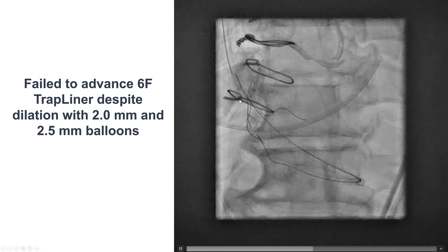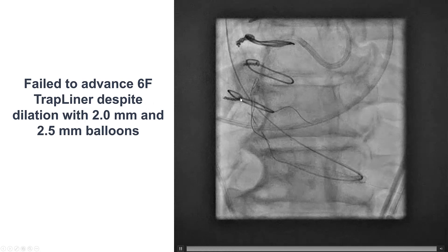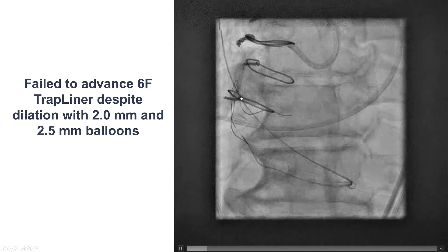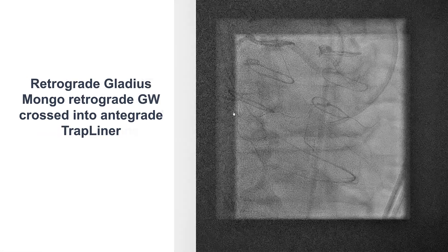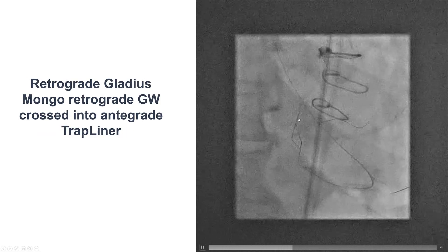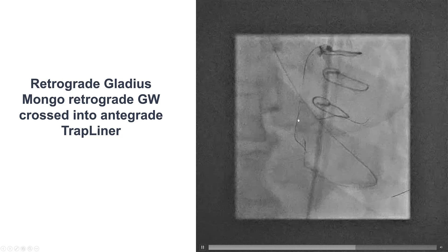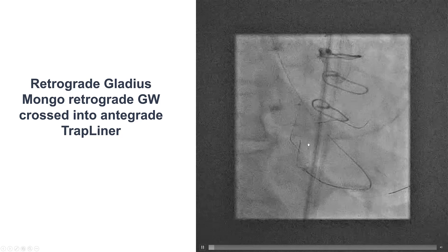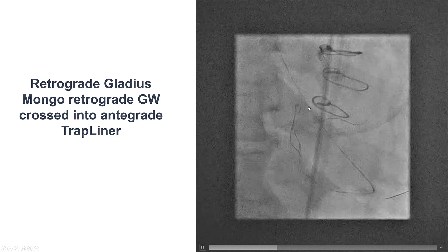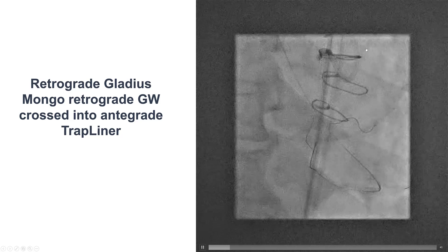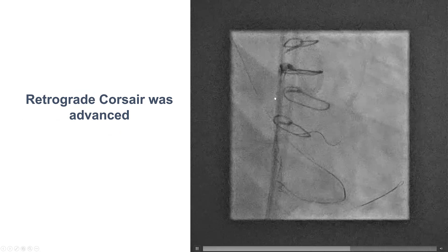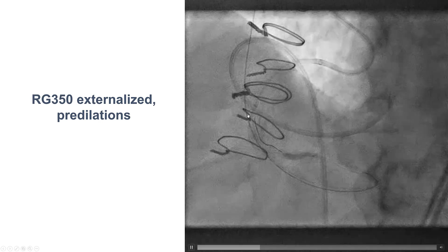However, our problems were not solved. We were unable to advance an antegrade guide extension, even after balloon dilatation of the mid-RCA with 2.0 and 2.5 mm balloons, and the lesion continued to be uncrossable with guide extensions. But eventually, we were able to advance the retrograde Gladius Mongo guide wire into the antegrade guide extension and then all the way into the antegrade guide catheter, advance the retrograde microcatheter into the guide extension, and externalize an RG350 guide wire.